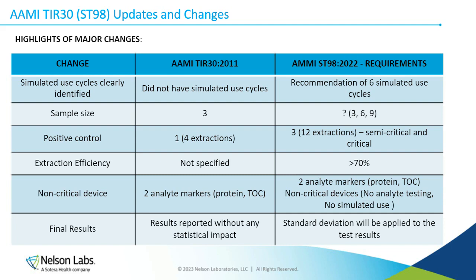And simulated use is not required for non-critical devices. You can just do your testing without the simulated uses, and just do visual inspection, wipe it, it's clean, it's good to go. So that is a huge change to these types of devices. It is a plus for the manufacturers because cost has gone down and it doesn't cause a lot of problems. But for disinfection, it's still a juggling factor for us, which you'll hear about tomorrow from my colleague.